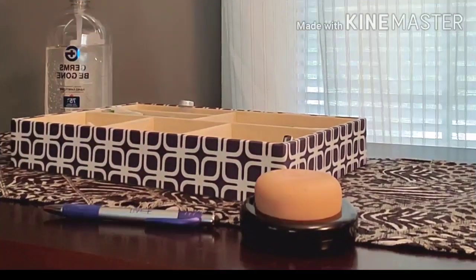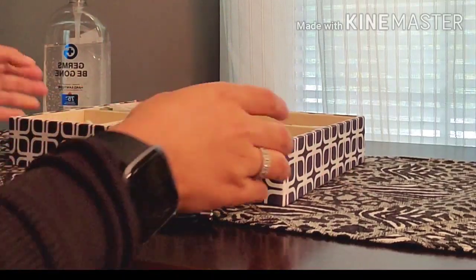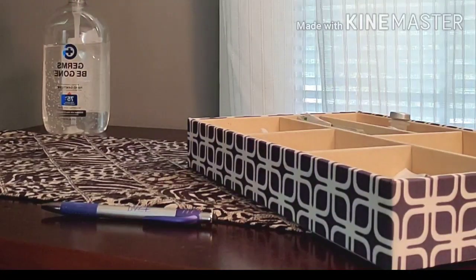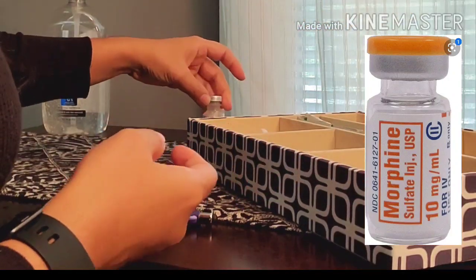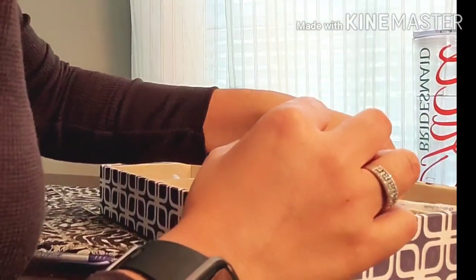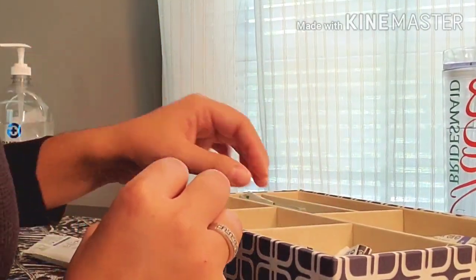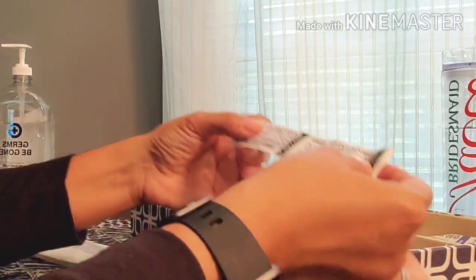Next, I'm going to gather my supplies. The first thing I always do is perform hand hygiene, even while gathering supplies. I'm in my med room gathering morphine out of the Pyxis — 10 milligrams per milliliter, and I want to administer 0.2 milliliters for 2 milligrams. I'll grab my one milliliter syringe and a one and a half inch needle, because Jason has a pretty large deltoid.